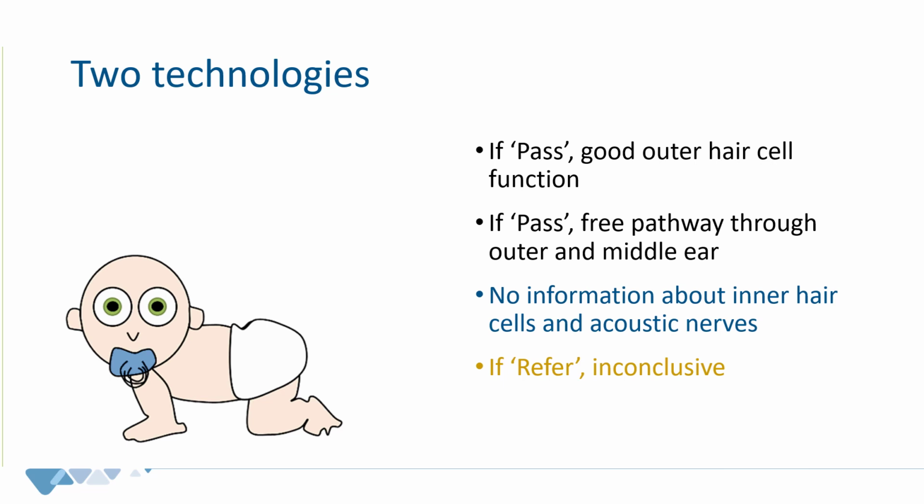if there is a small hiccup in the middle ear, not even significant to be of influence on the hearing itself, the OAEs are at such low levels that if it gets damped on the way out, you don't measure it. And if you present a stimulus, it gets in slightly lower, and then the OAE gets out slightly lower as well. So small problems in the middle ear, not significant in itself, will already cause the OAE to not be able to be recorded.